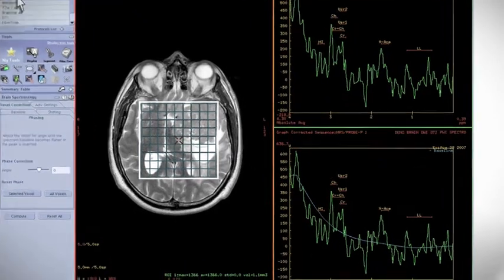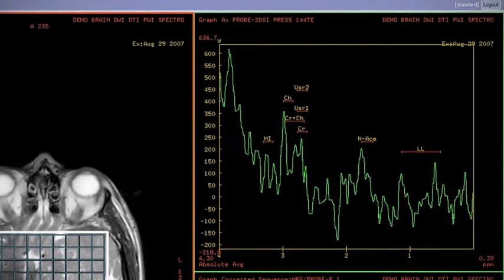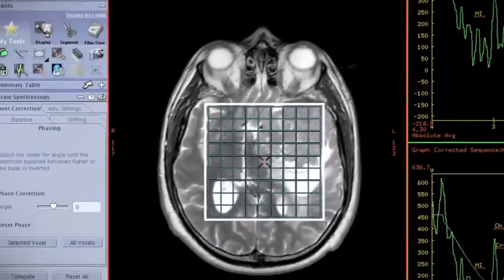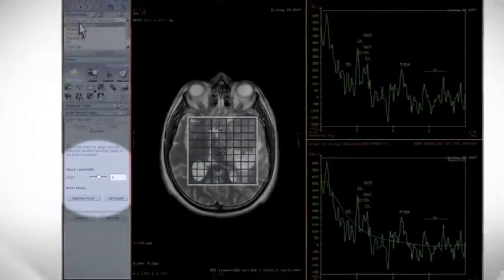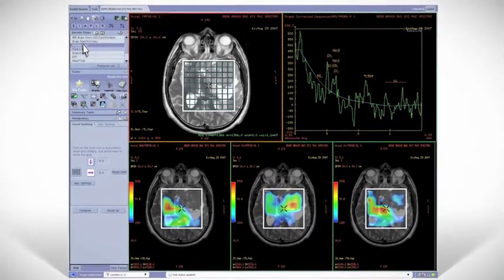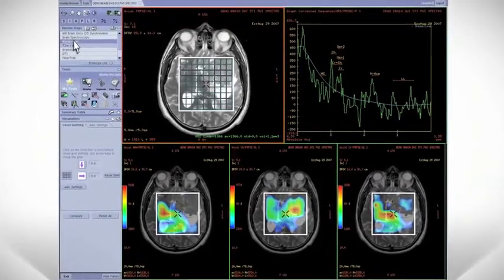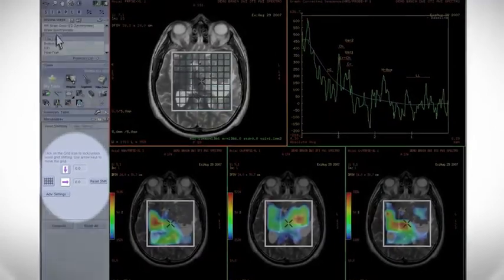For instance, an easy-to-read graphical interface to display time curves, functional curves, or spectrum. Or the ability to click on any voxel to see the spectrum and use the real-time slider bar to quickly adjust the phase. Within the Metabolite Maps review step, not only can you see the metabolite maps on top of the T2 localizer, but you can easily shift, compare, and reset the voxels.